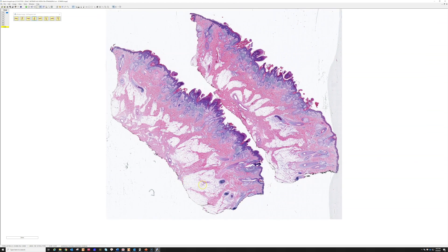What I want to point out first is that we're on the scalp. The scalp, unless the person's older and has alopecia, has very large anagen hairs that are in the anagen stage. Their roots are down in the subcutis. So the scalp and also the sideburn area have many large hairs with their roots in the subcutis. You can see that on both edges of this excision there are large hairs, and then suddenly the hair is gone on the scalp.